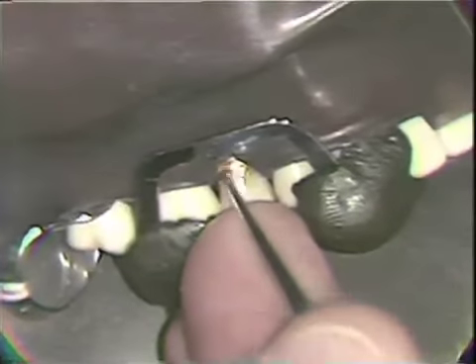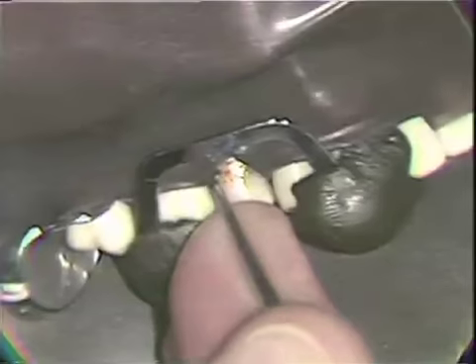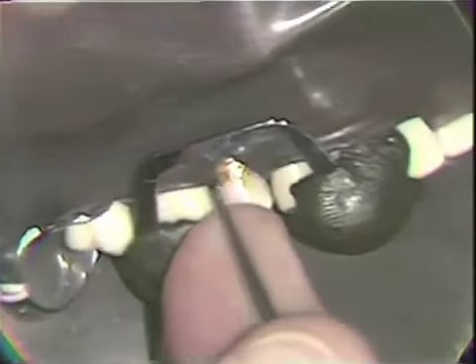The 5C continues to bring about the initial contouring of the foil with a fairly heavy, forceful burnishing action.